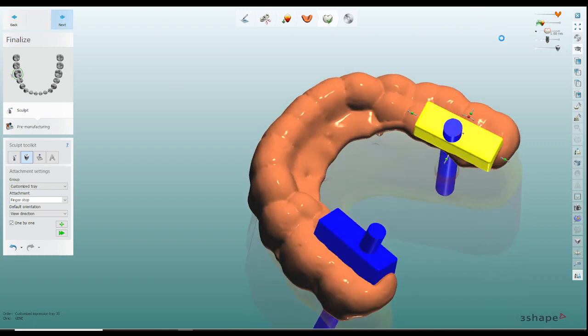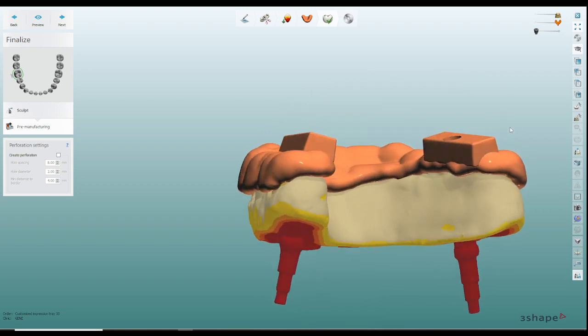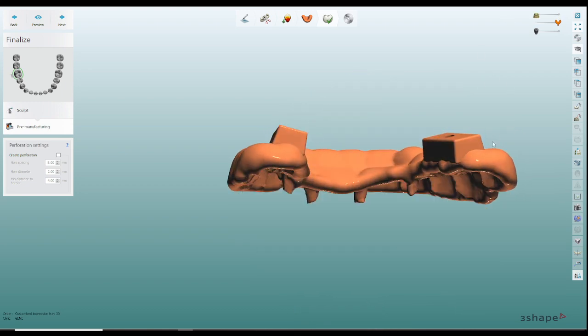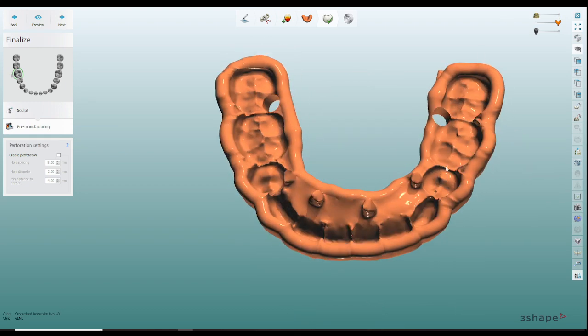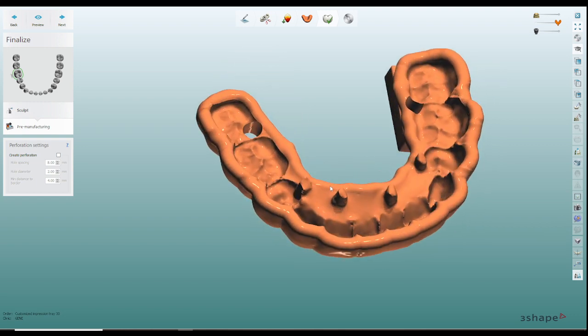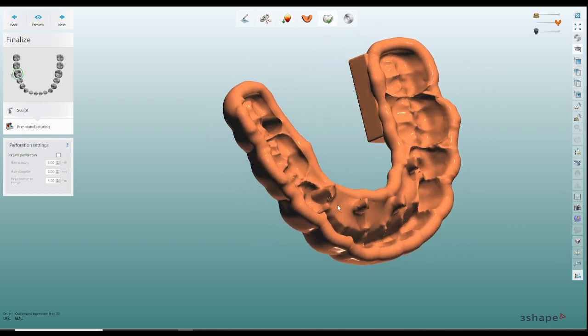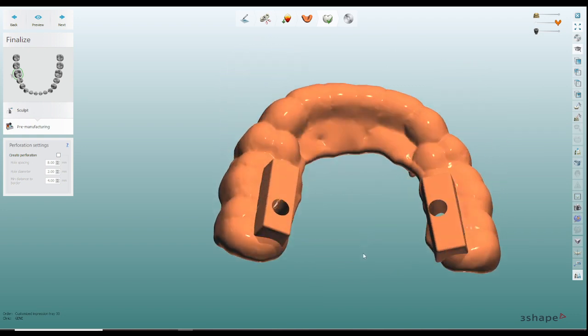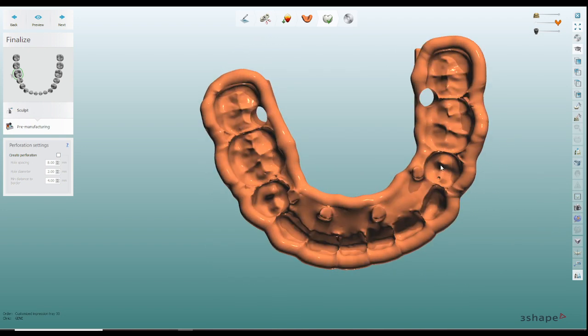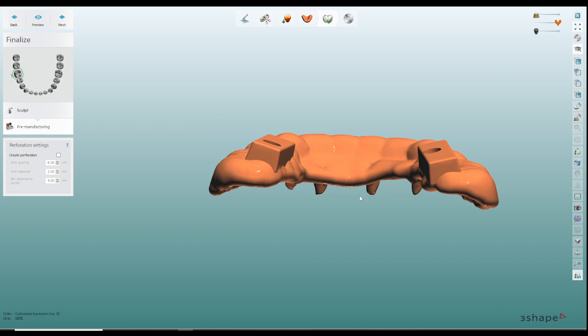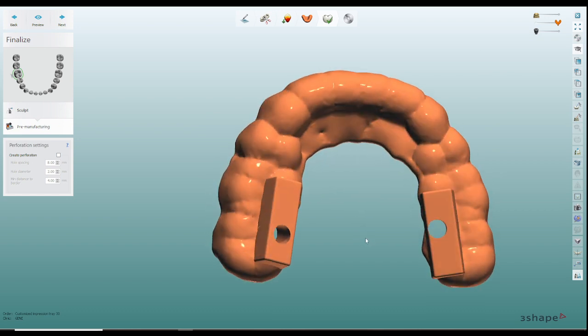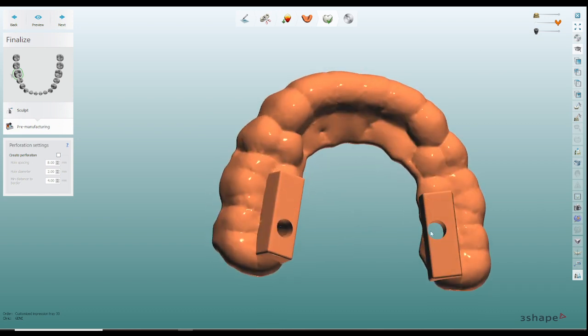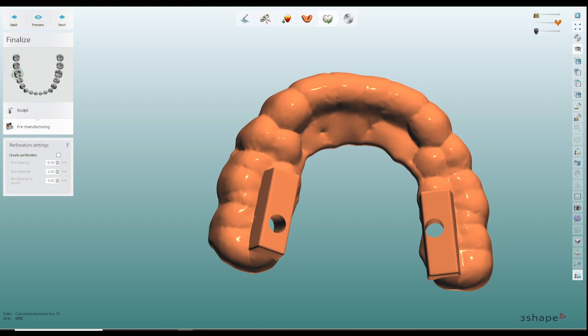When I click on next it should attach everything together, hopefully, yep and it did. When I remove the model obviously these areas I'm going to have to grind out either manually or I can just cut them out digitally, it doesn't really matter, or I could have done block out in that area. So here I have these little areas where I can put my guide tubes in.